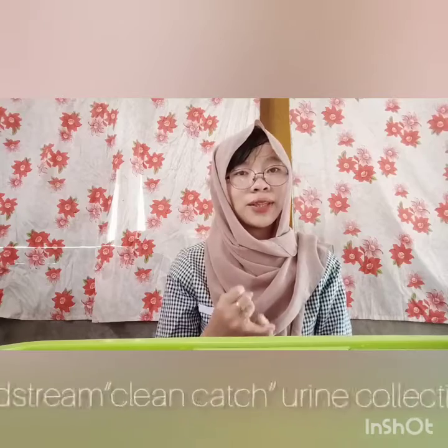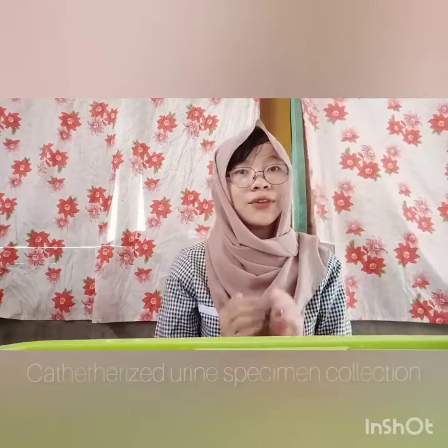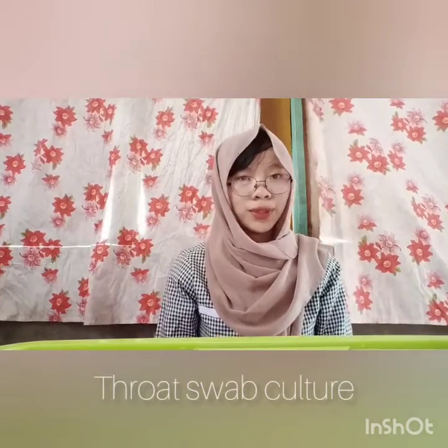entitled Specimen Collection. A specimen is a sample taken from the patient's body to use in diagnostic and laboratory examination. There are some types of specimen collection: clean catch or midstream urine collection, 24-hour urine specimen collection, urine specimen collection from an infant, catheterized urine specimen collection, stool specimen collection, sputum specimen collection, and the throat swab culture.